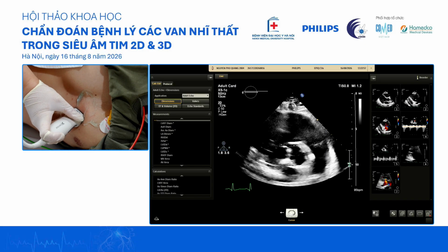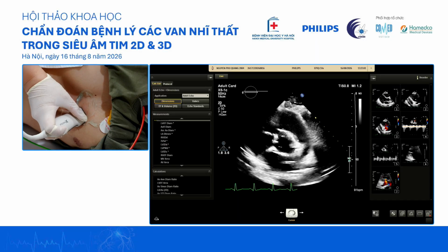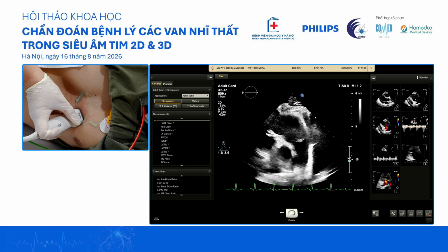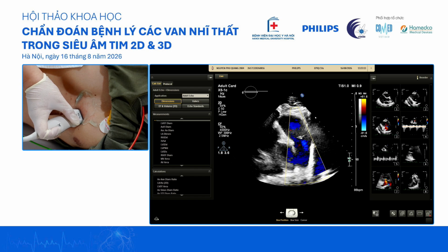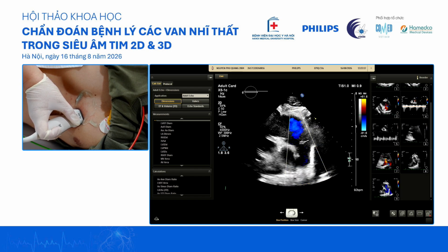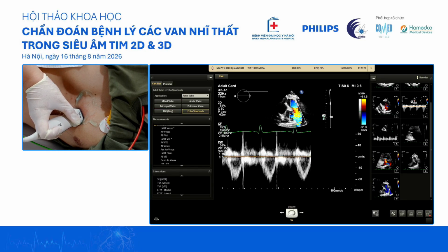We go to the short axis. So this is very important because we're also looking at the pulmonary pressures. So we want to visualize the pulmonary artery very well. Và cái này rất là quan trọng vì chúng ta đánh giá cả động mạch phổi nữa, đo kích thước và áp lực động mạch phổi nữa. And we want to get the Doppler signals.